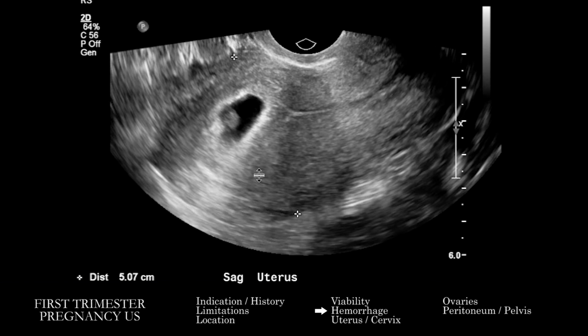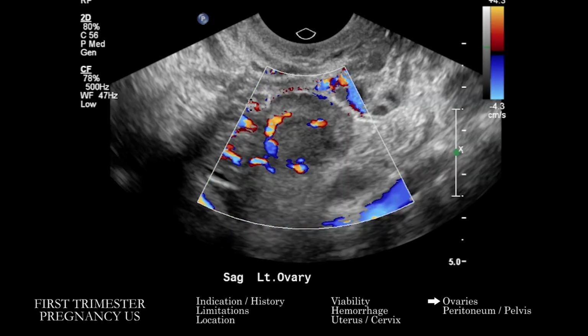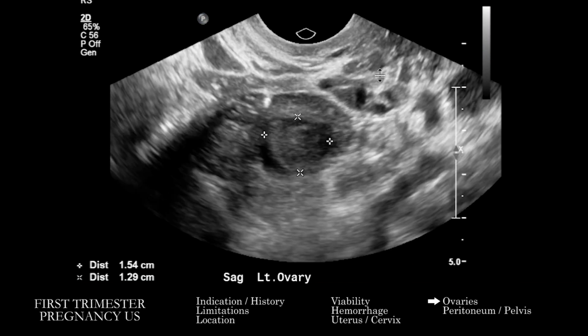I've glossed over that we are also evaluating the cervix, the uterus, and eventually the ovaries, and these are assessed generally in similar fashion as in the usual transvaginal or pelvic ultrasound. It's important to get a sense of the ways it differs, especially with the cervix, where we talked about open and closed, or other changes.